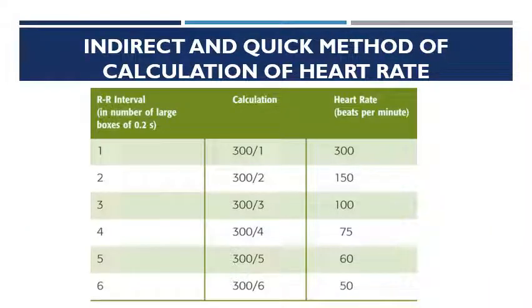Next is the indirect method of calculation of heart rate, and this is basically a quick method of determining heart rate from ECG.